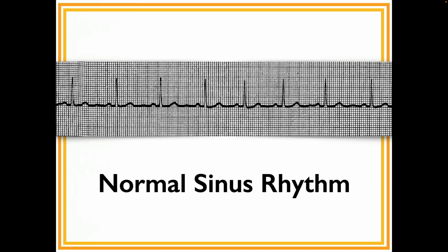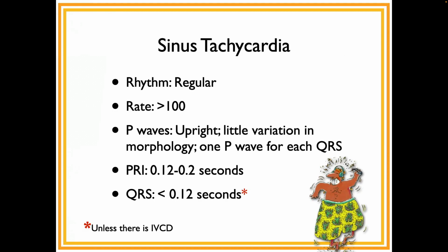This is a normal sinus rhythm, okay? And again, we're going to have lots of time to practice, so you're going to see lots of normal sinus. But we're just going to move through all of them, and then we'll start practicing. The way I made this slide is I took the normal sinus rhythm slide, changed the picture, and changed the rate. Everything else is exactly the same. There's no difference between normal sinus and sinus tach other than the rate.